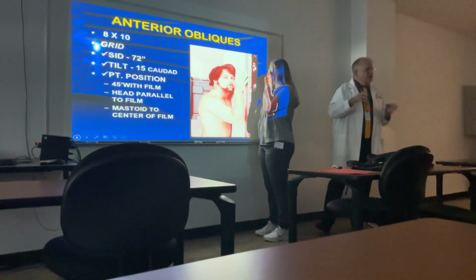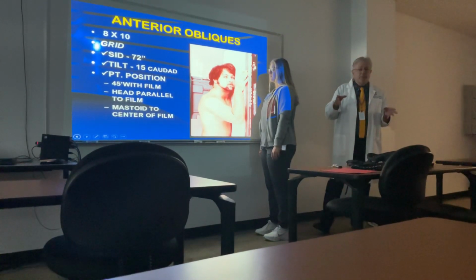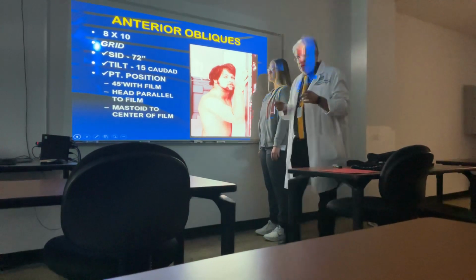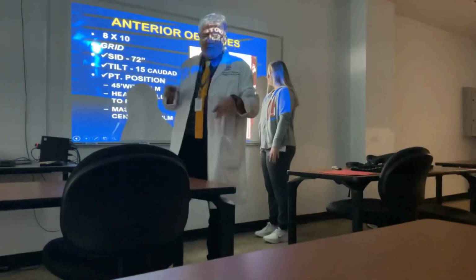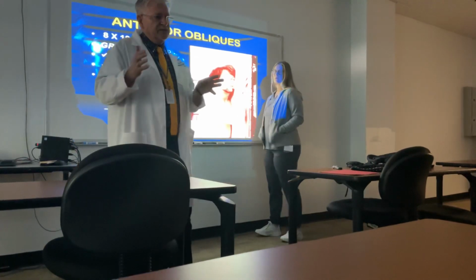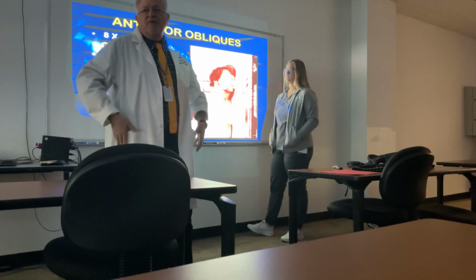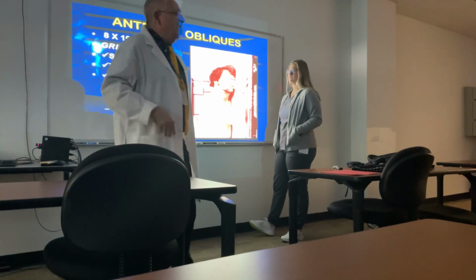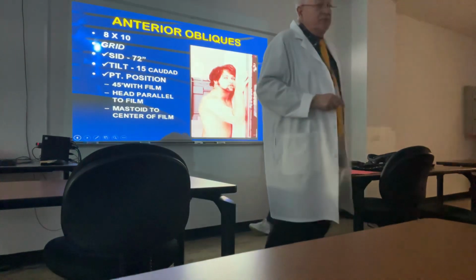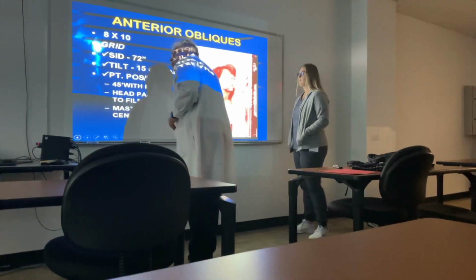So everything else in terms of steps stays the same. But the idea is we want to see the IVF, right? The question is which one? And that's where it becomes a lot more challenging. Now I don't know which way works best for you, so I'll show you a couple different ways. The first one is on a right anterior oblique view, I will see the right IVF. If you want to write that down, or I'll write it down on the board so we have it correct.